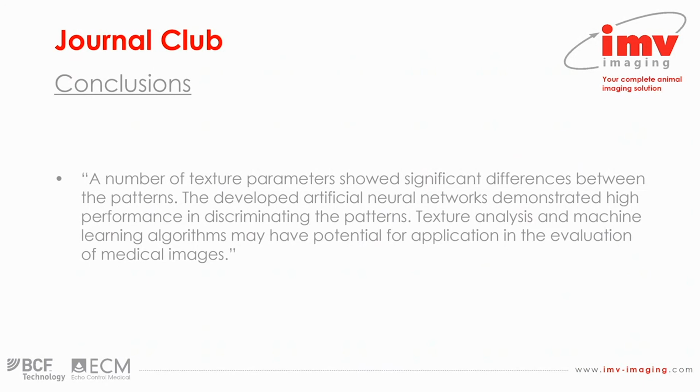However, they don't really make any mention of clinical application in the real world, other than their acknowledgement of the fact that the mixed or less obvious patterns may be harder for the algorithm to detect, and therefore certainly the results that were achieved on more real world data where they haven't been selected so carefully may be different. That may improve the performance, it may reduce it, they don't know.